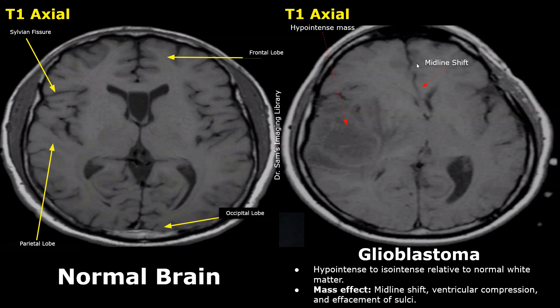This is another case of a glioblastoma. The mass is present in the right parietal lobe and also appears hypo-intense to the white matter. There are cystic and necrotic areas within the mass. A midline shift is also present in this case. Effacement of sulci refers to the loss of grooves that we normally see in a normal brain — the sulci have disappeared here. These small areas outside the mass are edema.